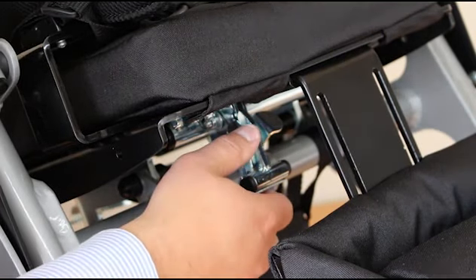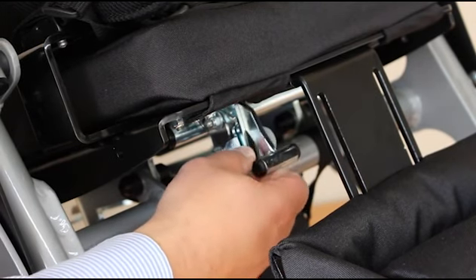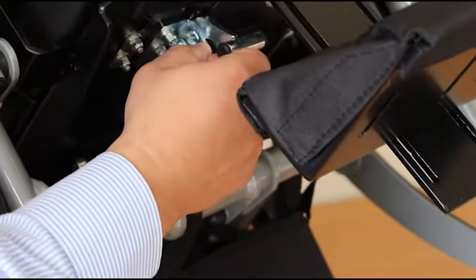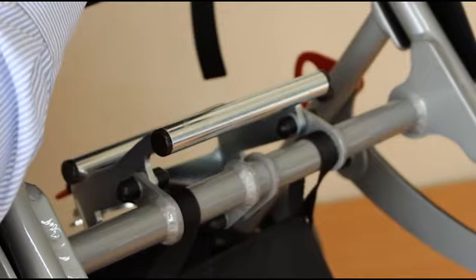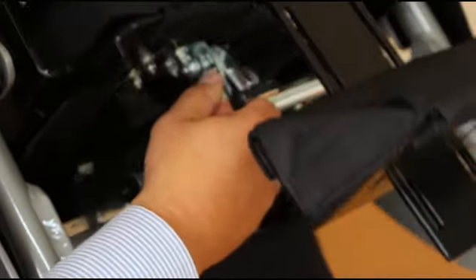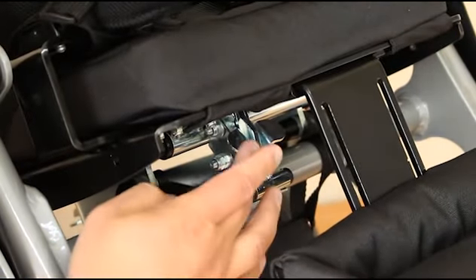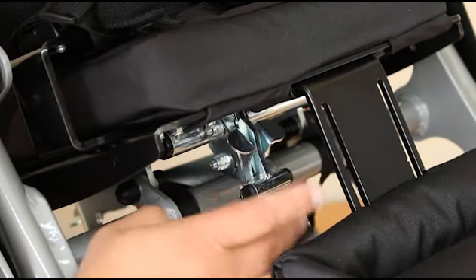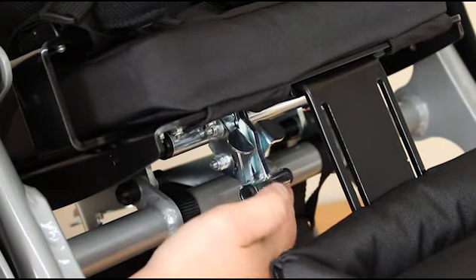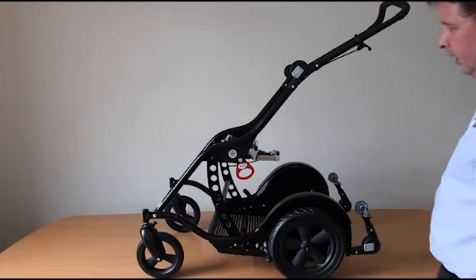The seat unit is removed by pressing the catch here — the safety catch is pushed backwards and the front catch is pulled forwards, which releases the seat from its base. Tilt it back to remove. To refit, make sure the hooks are located against the rear front bar, then push the seat forwards to relocate the catch. Make sure the safety catch is fully clamped against the back of the other catch, indicating the catch is fully engaged.